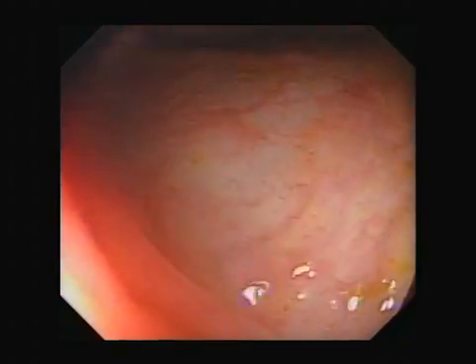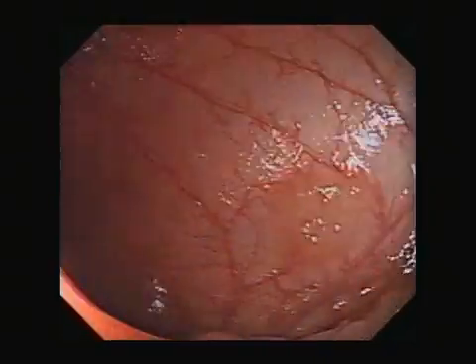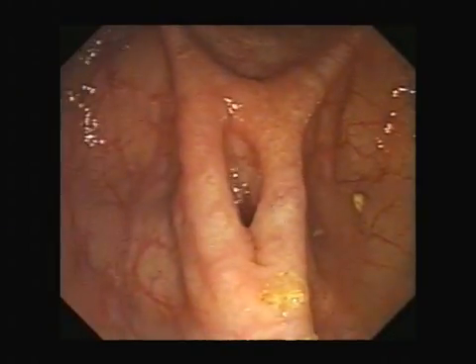Arriving at the ileocecal valve and its slit opening, the scope is steered in and, with a little patience, passes into the nodular, villous surface of the ileum, sometimes with visible vessels and opaque Peyer's patches of lymphoid tissue. Alternatively, seeing the appendix direction, angulating and pulling back, it may fall into the rough surface of the ileum.